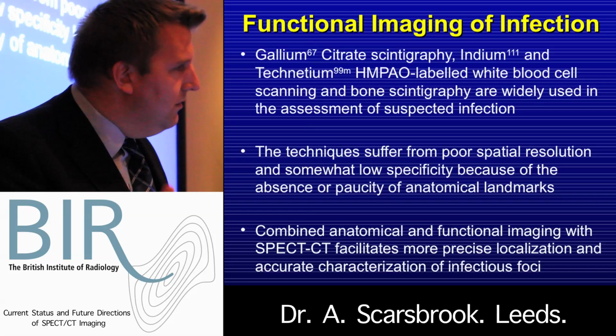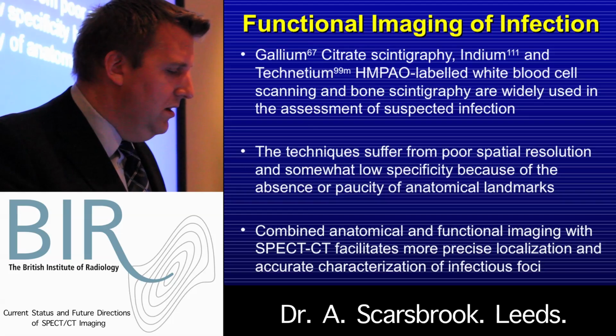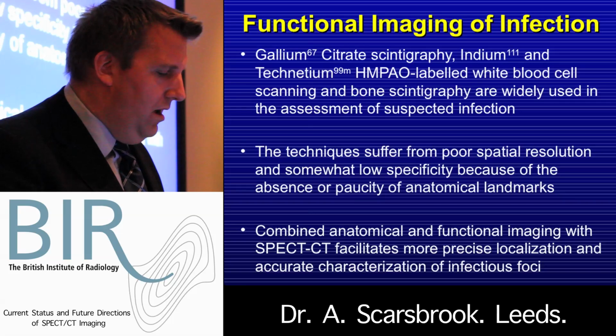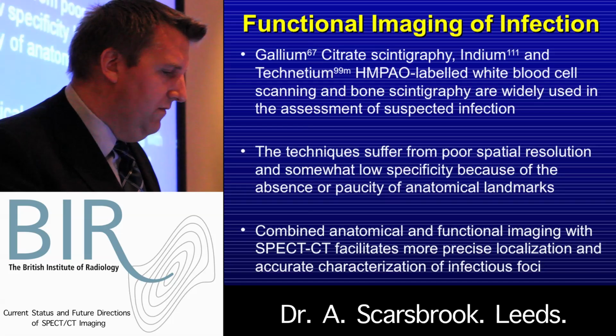As we've heard frequently throughout the day, the main criticism of planar imaging is the poor spatial resolution and the low specificity, and really adding in CT brings things together and improves the quality of the study overall.